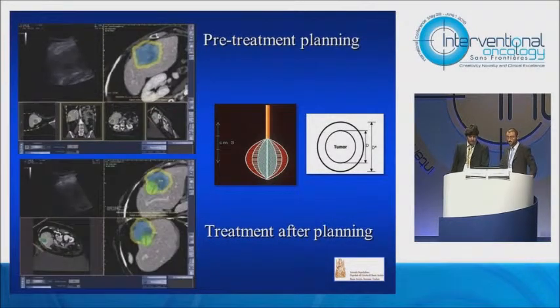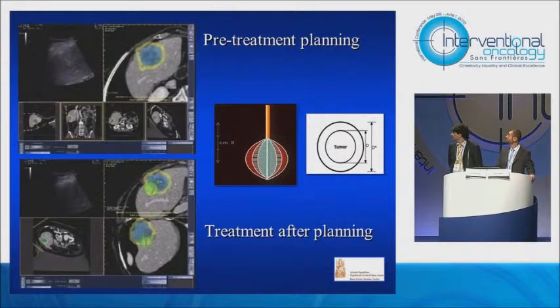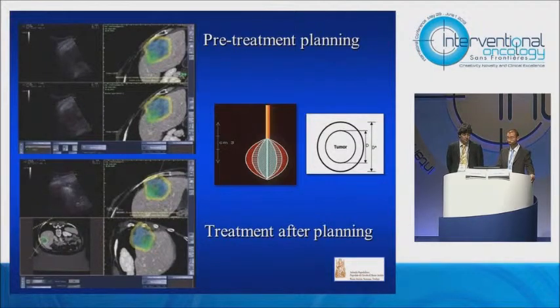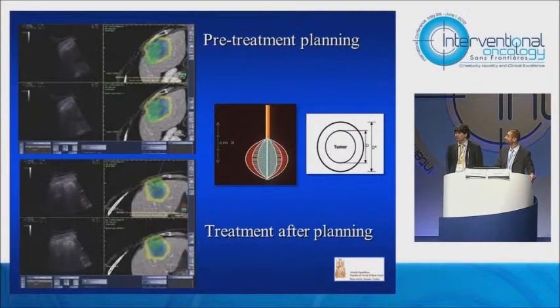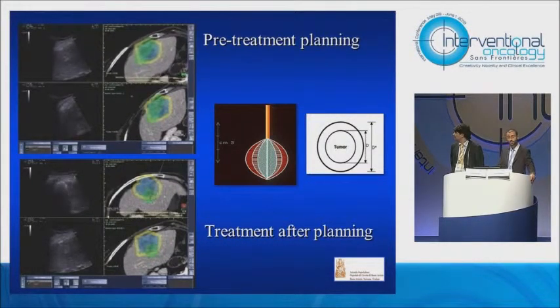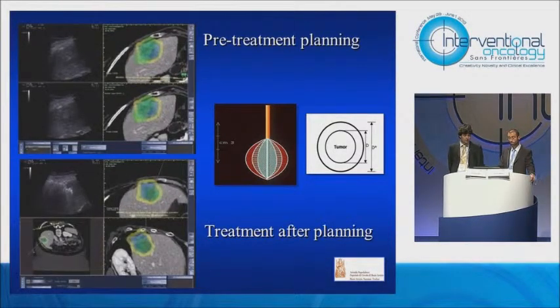Again, we used this in several patients, and we found it extremely useful. We use this to plan the procedure and understand before the procedure how many insertions we will need and how to correctly plan the procedure. And then during ablation, as you can see, you can place needles several times and cover the whole tumor with different ablations.